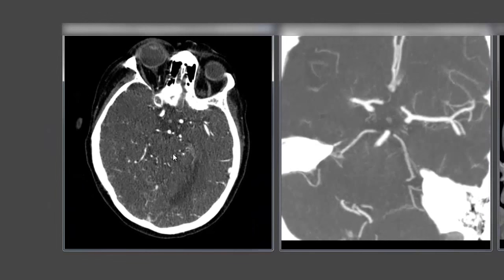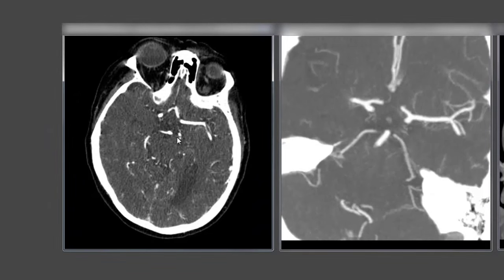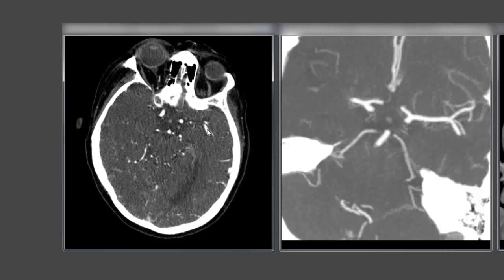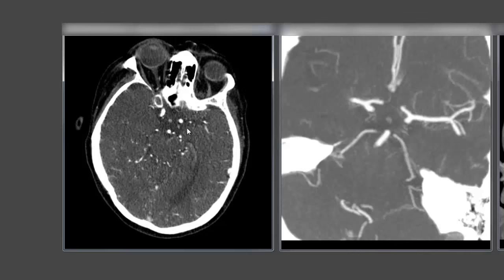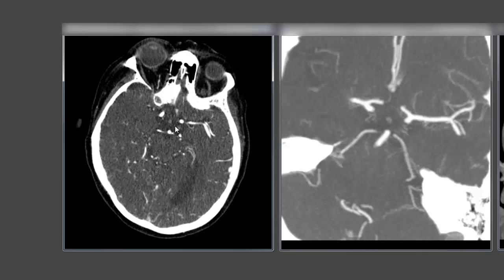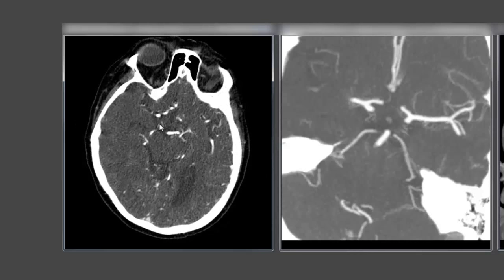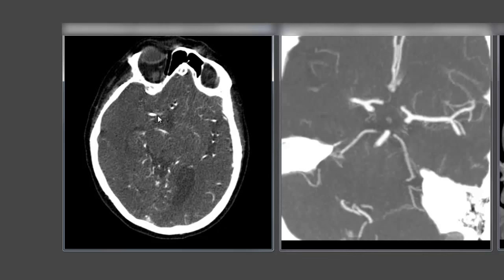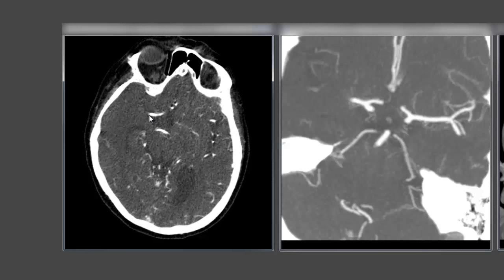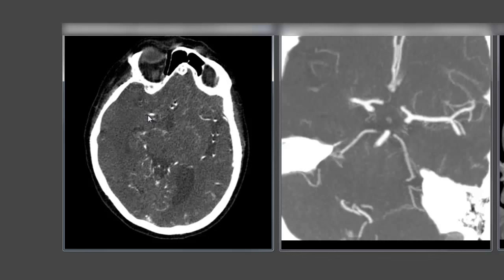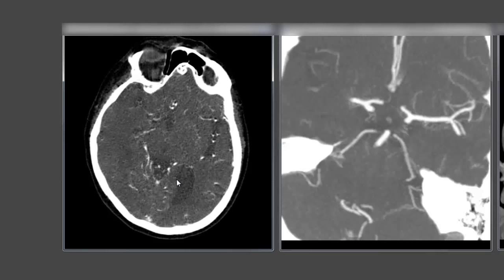Scrolling on our source images, we see the normal left MCA here with a nice MCA bifurcation. Looking at the opposite right side, we see a hard stop — a large artery occlusion in the right MCA stem — in this patient presenting with left hemiparesis, neglect, and gaze deviation to the right.